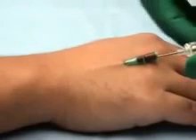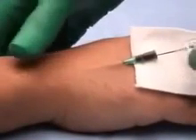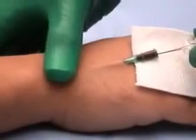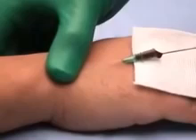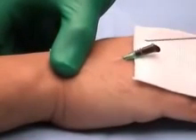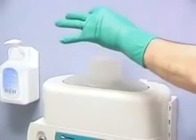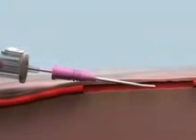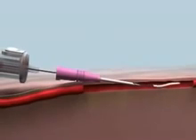To prevent blood loss from the open plastic cannula hub when the metal needle is removed, place direct pressure over the vein proximal to the end of the catheter, and place a gauze pad beneath the cannula hub. Remove the metal needle from the plastic cannula and place it in the sharps container. Never attempt to reinsert the metal needle into the plastic cannula. Doing so may shear off the plastic cannula, releasing it into the bloodstream, resulting in a possible embolus.